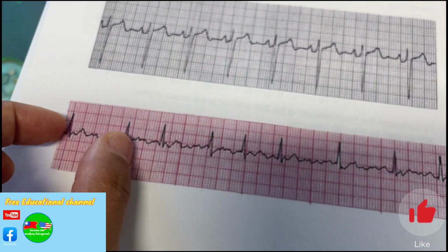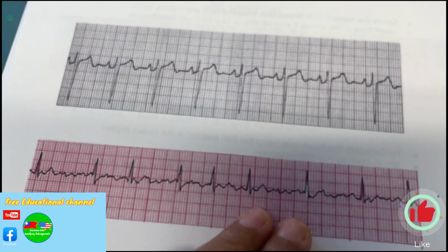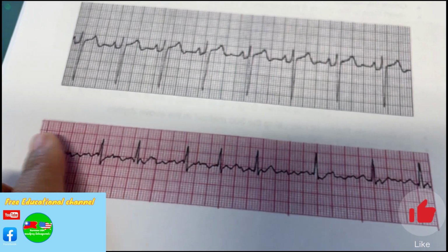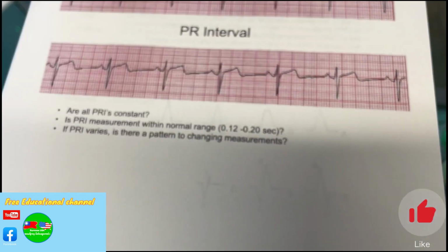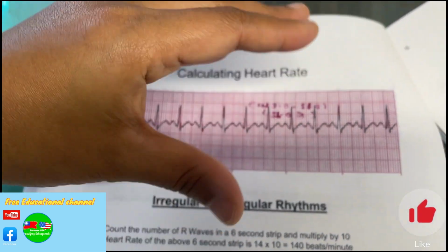Atrial fibrillation could be an irregular rate and could have a lot of waves in between, and it could also be regular. It could be regular, like 90 beats. It could be not tachycardia or anything like that, but your atrium is actually having a fit, okay?